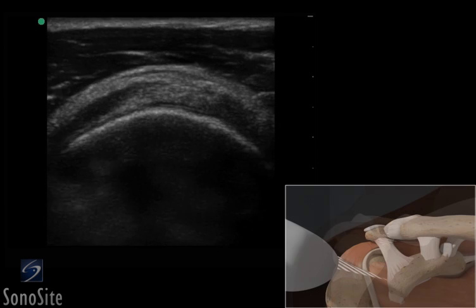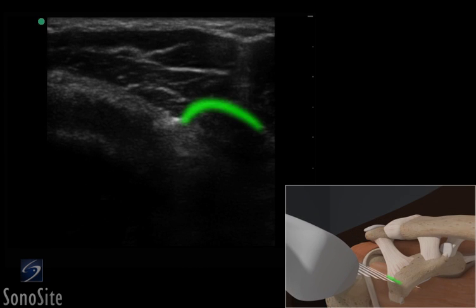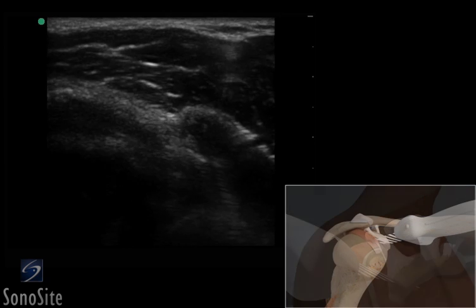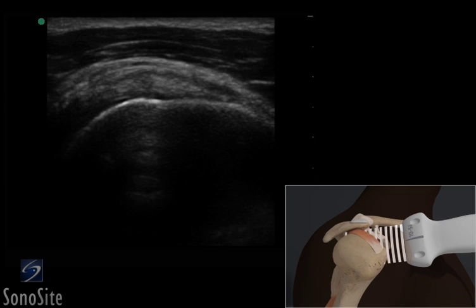The transducer is then moved slowly medially until the hyperechoic coracoid process can be seen. The biceps tendon will come into view in the mid portion of the screen as a hyperechoic circular structure, with the subscapularis tendon to the right and the supraspinatus tendon to the left of the image. The transducer is then rotated clockwise with the orientation marker directed at a 2 o'clock position.